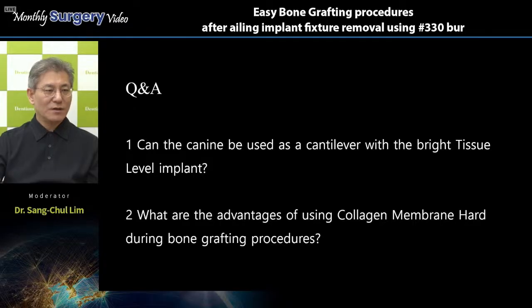I'm gonna take 2 questions. Very nice, a good question. Thank you. First, number 1, can the canine be used as a cantilever with a Bright tissue level implant? Of course, yes.